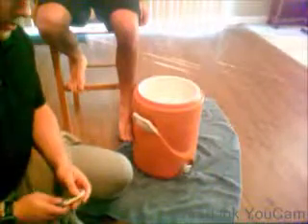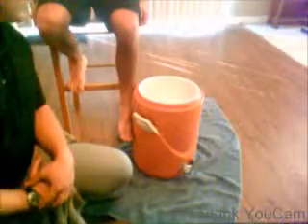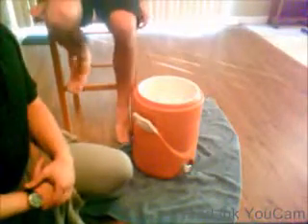Also, you want to assess for contraindications, which we went through before, and make sure that if the patient has any cardiovascular issues, which he does not, we assess all vital signs, including respiration rate, blood pressure, and heart rate. So the patient here will place his foot into the tub. You ready? Yeah, go for it.